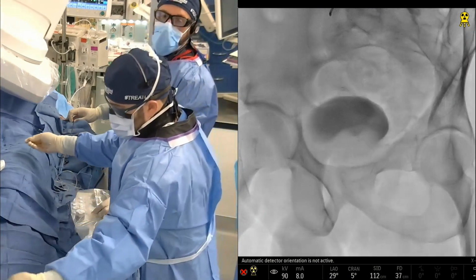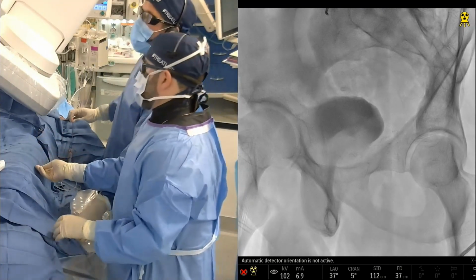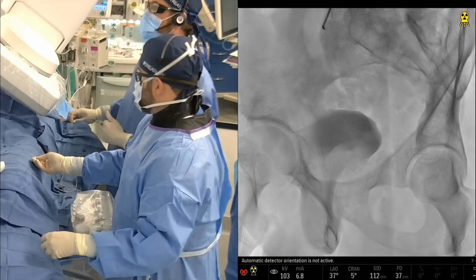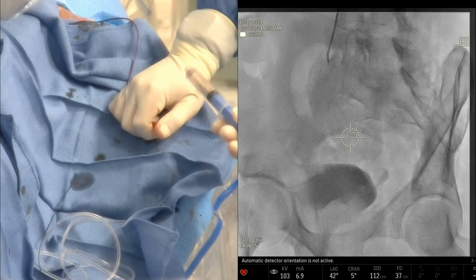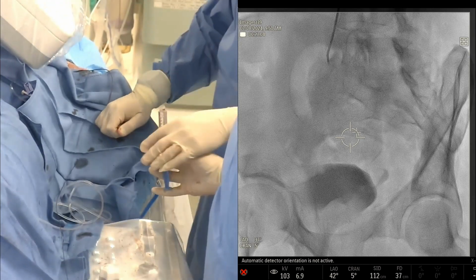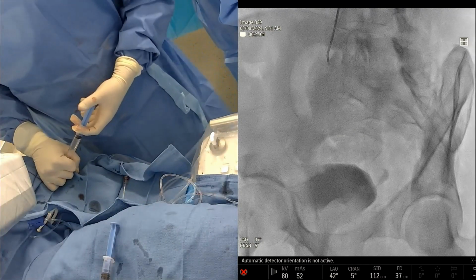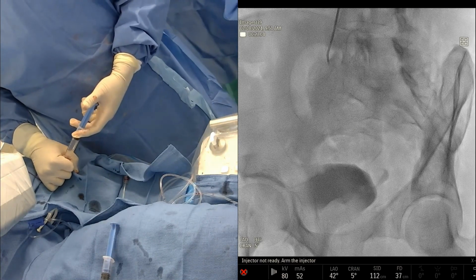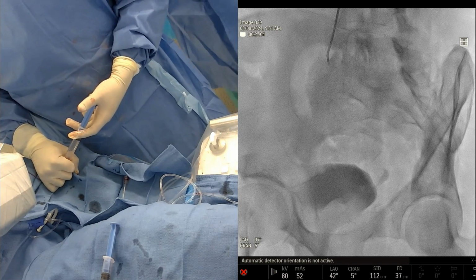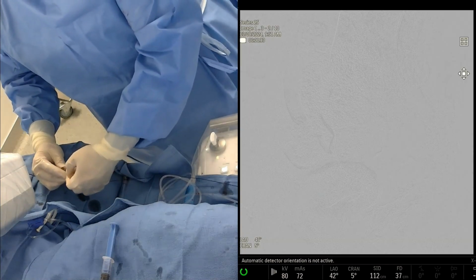But there, it's probably about half and half, right? Yeah, that's really what it is. Half the time it's through collaterals and half the time it's through the main parent vessel. I have not seen recanalization through the main prostate artery with glue. You absolutely can see collaterals if you don't occlude them, but the main vessel does not remain patent, and the branches that you've embolized do not remain patent. It's about half and half, but I haven't repeated a lot of glue patients.